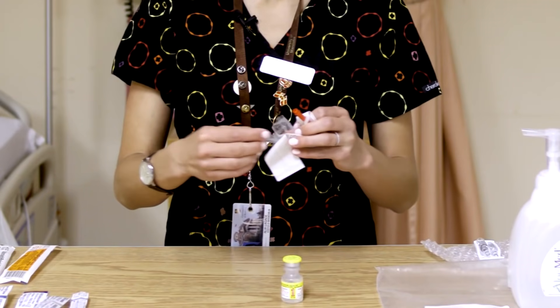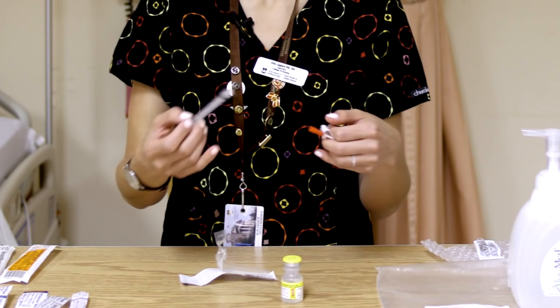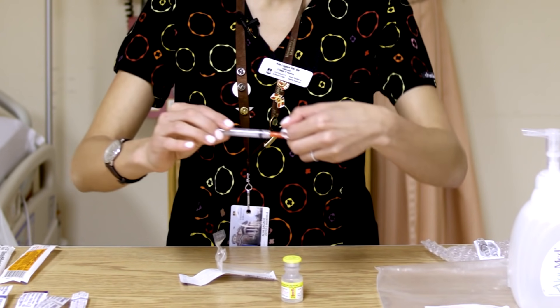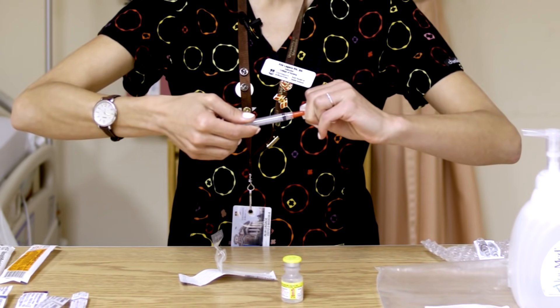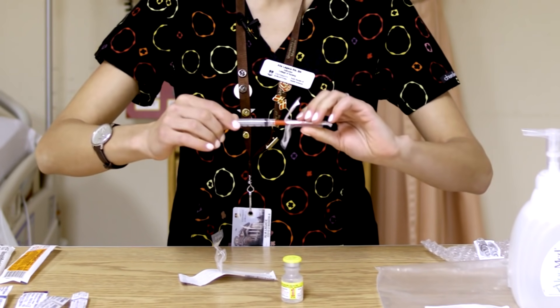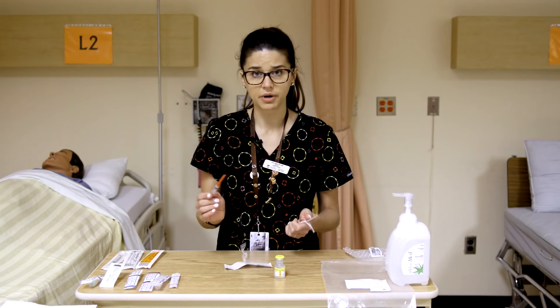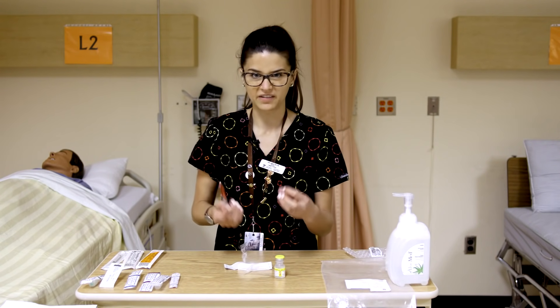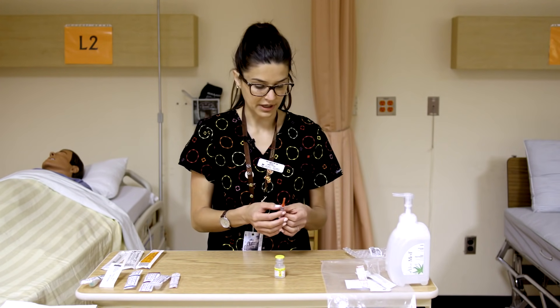Same with our syringe — we're not going to touch the tip of our syringe or the hub of our needle. We're just going to connect the two. It's a lure lock: a twist motion while you push at the same time. You don't have to do it too hard — you don't want anything to break — but you do want it securely on there so nothing is flying around.